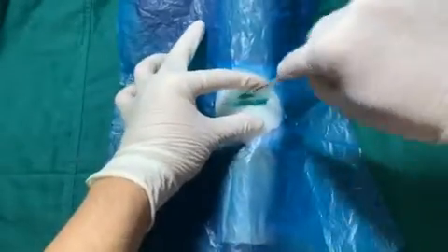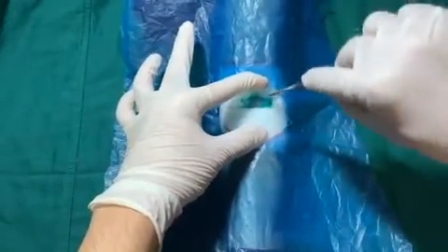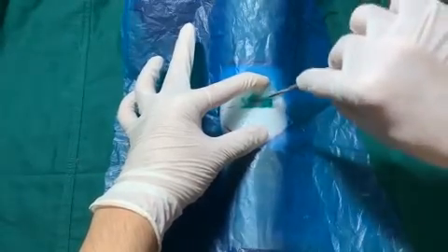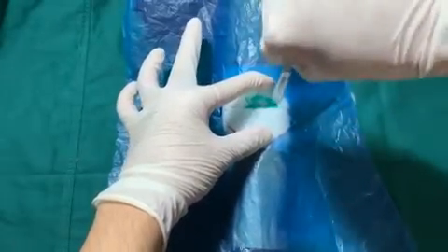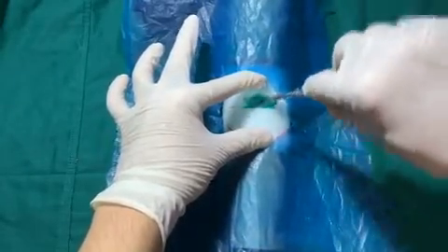Extend the incision through the skin, subcutaneous tissue, and the platysma. Take care not to transect the anterior jugular veins, which are just superficial to the strap muscles within the cervical fascia. They can be preserved and retracted laterally.